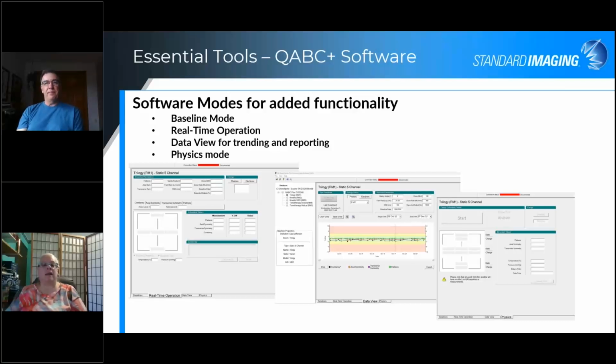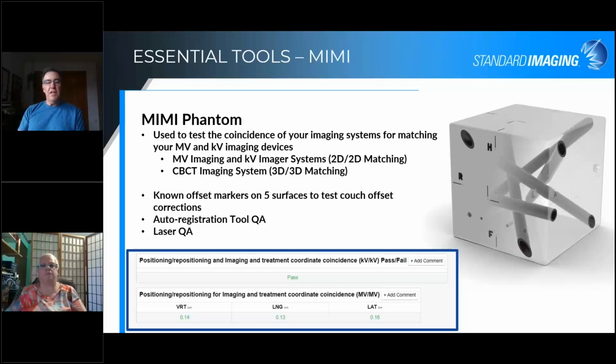So I think we've covered the daily dosimetry and the table one of TG142. Let's chat a little bit now about table six, is it? Table Imaging six, yeah. What tools would you recommend for that? Okay, so basically, like I said, the imaging table in TG142 for the daily component is not image quality.